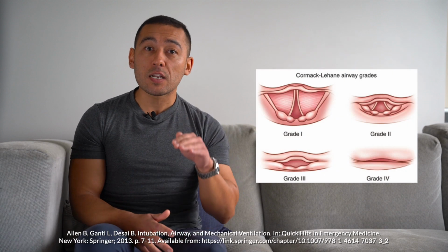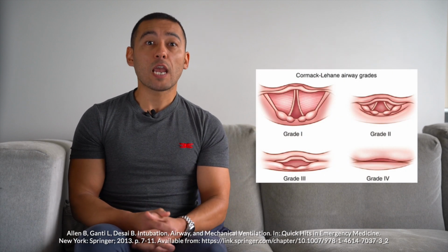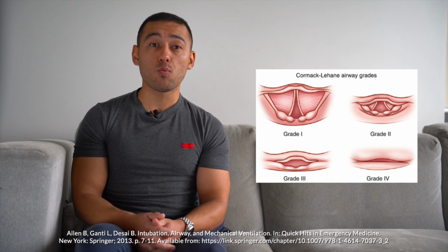The epiglottis and posterior cartilages are the two most important landmarks, as they indicate the upper and lower boundaries of the glottic opening. If you see both of these, you know you have a grade 1 or 2 view and can aim straight through the middle. With the glottis now visible, verbalize your grade of view and then insert the endotracheal tube.